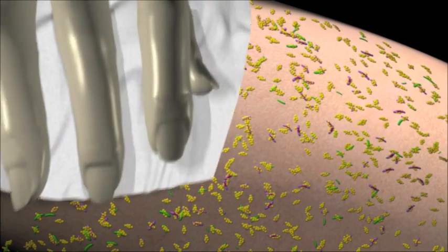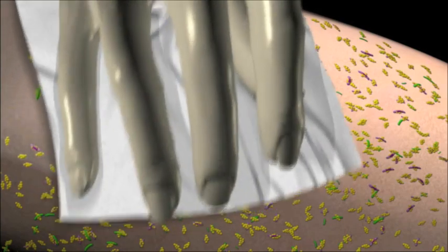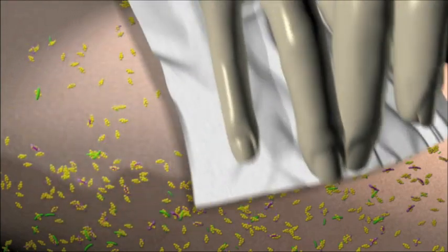According to hospital protocol, a one to two minute scrub with a chlorhexidine pre-operative skin scrub 2% CHG cloth is recommended.